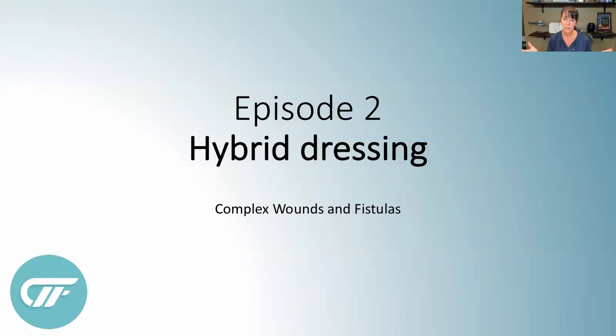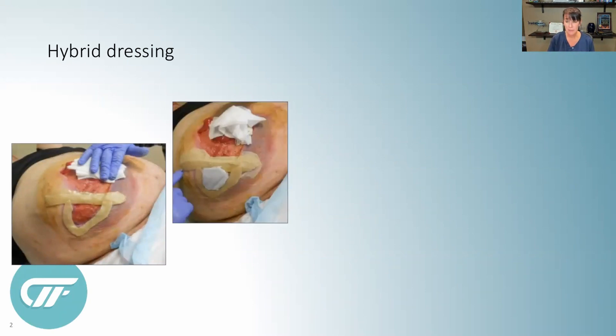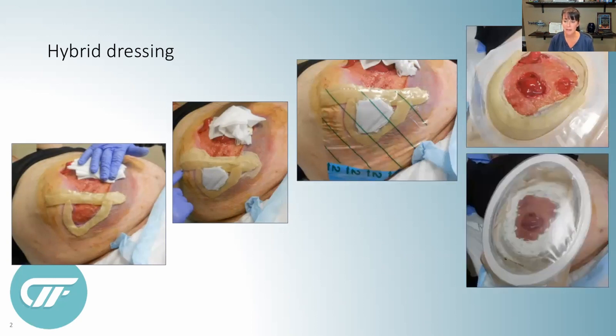Episode two is the hybrid dressing — making big wound managers or pouches into smaller pouches by using other advanced wound dressings. Today we're going to talk about Big Mike, who had a real big wound with a bunch of fistulas. He wanted me to isolate the section he called his dog leg so he could get into the next smaller size wound manager. I'm using barrier rings like in the sandwich technique from episode one, placing them down to isolate a section, then putting a long-standing silver dressing in there to be changed on the Monday/Thursday pouch change. Then I used some clear drape to cover the whole thing and the sandwich technique to hold the pouch in place.